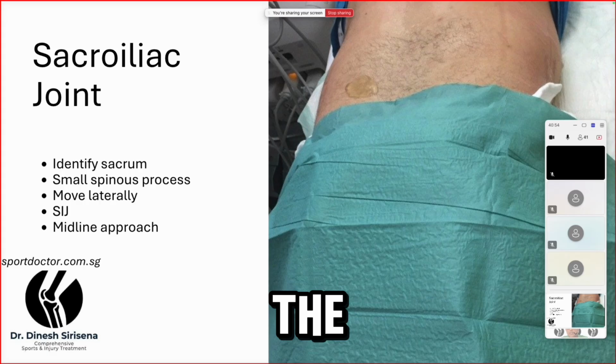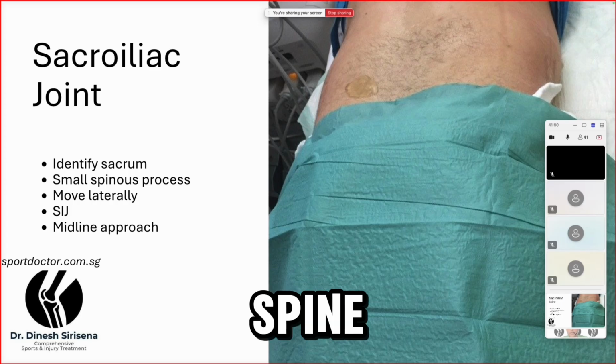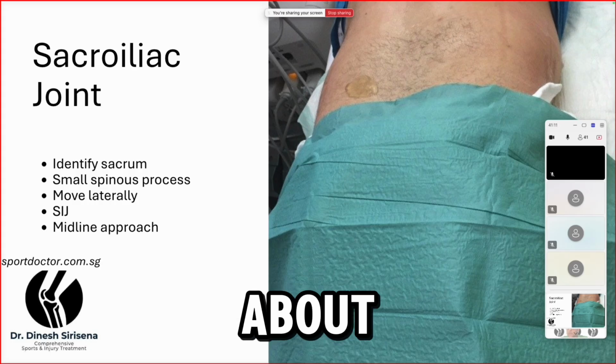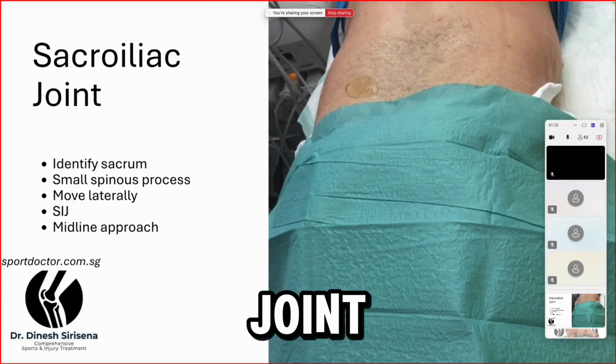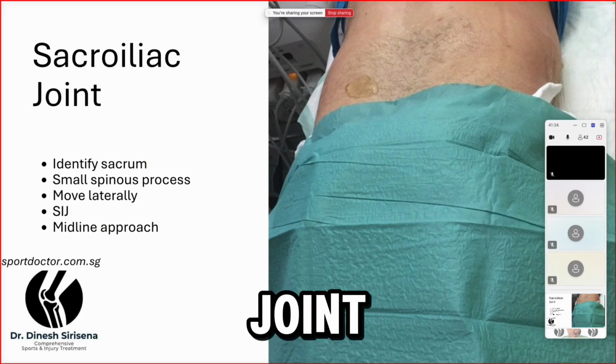Again, actually, the sacroiliac joint was my starting point in my journey in terms of dealing with the spine and the lower back. I first came across this with, I think it was Jenny Saunders, who years ago came to visit us and was talking about PRP, even back then, in the SI joint as a treatment for SI joint pain. So I started off with SI joints. You can either do it higher up at the PSIS, but that's only part of the joint, or you can do it at the more cartilaginous part lower down, and that flows a little bit more easily into the SI joint as well.